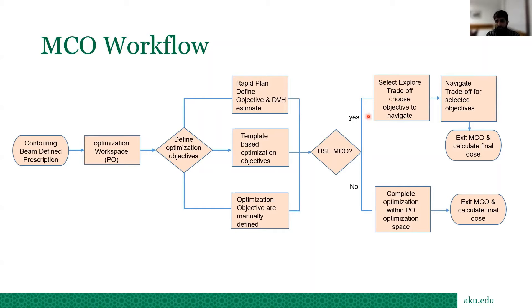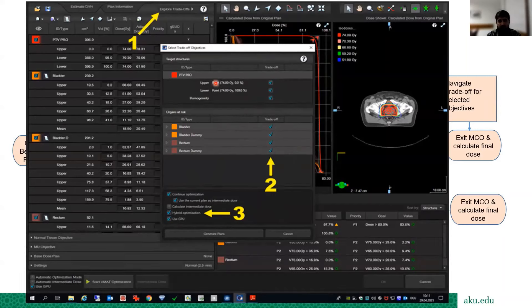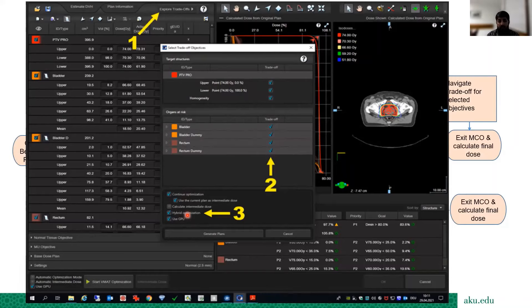Once you click 'Trade-off,' a window appears with the Explore Trade-off button. Click this and a selection window appears where you choose your objectives — PTV upper, lower, homogeneity, and all other objectives in that particular plan. You can also select rings or avoidance sectors. If you have a GPU in your system, enable hybrid optimization or use GPU, as this significantly reduces computation time.